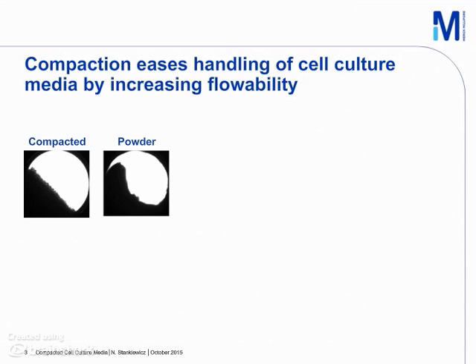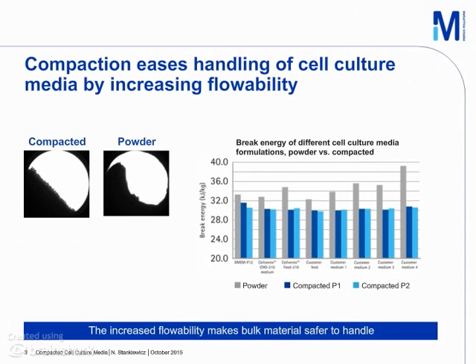The powder medium in the right-hand image has a steep angle and breaks rather than flowing like the compacted media in the left-hand image. This observation is confirmed by the measurement of break energy shown in the graph.